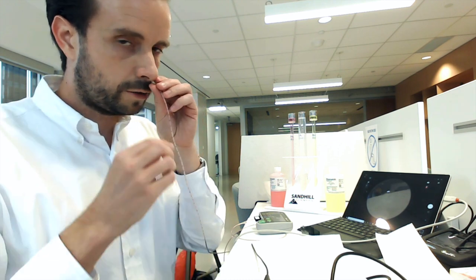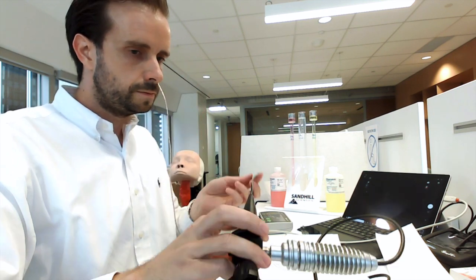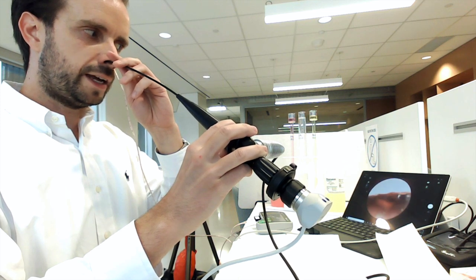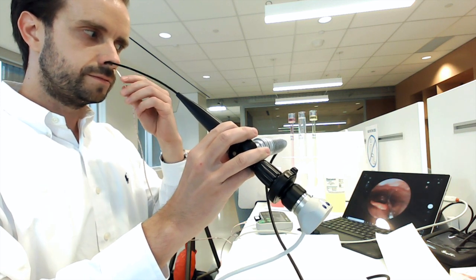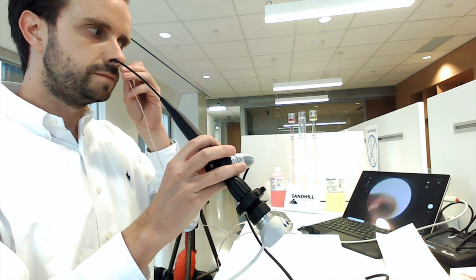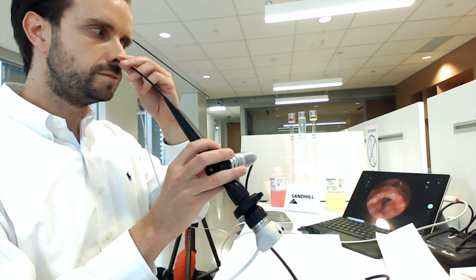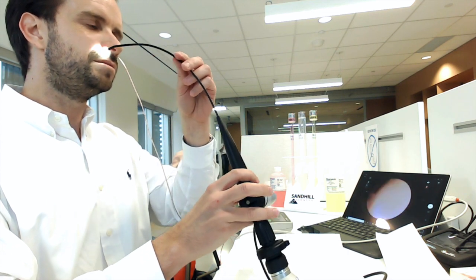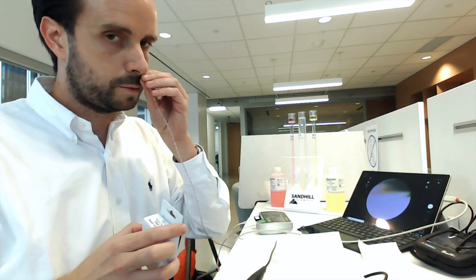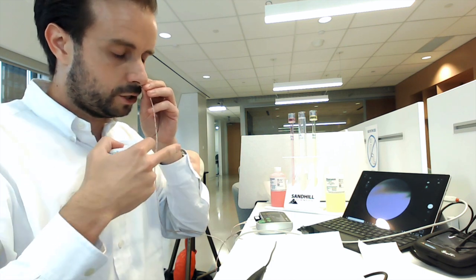Now we're going to go into the other nostril to look at the positioning. This blue marker here should be right at the UES. Okay, this is a great position. So at this point, we can tape the catheter and note the position from the nose.